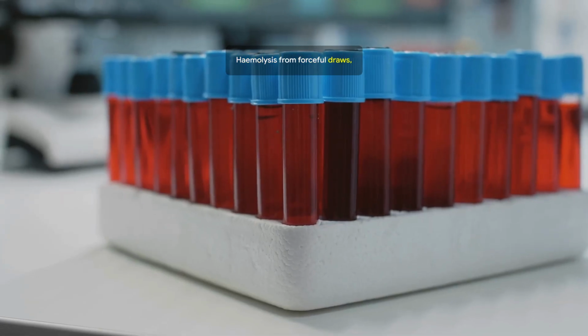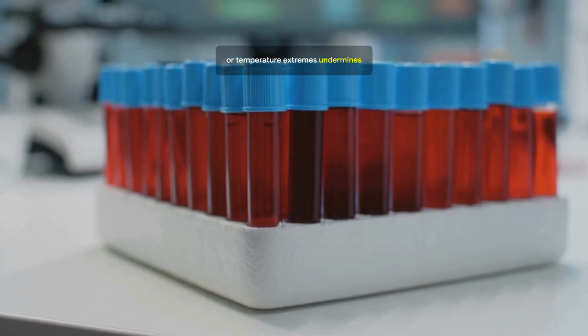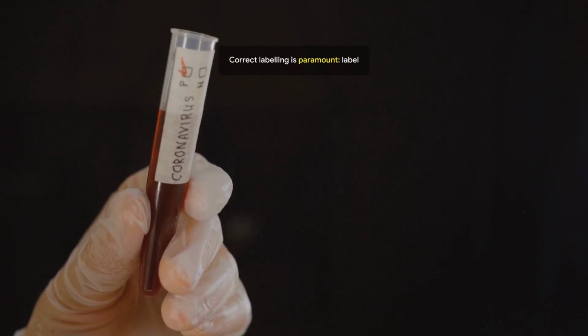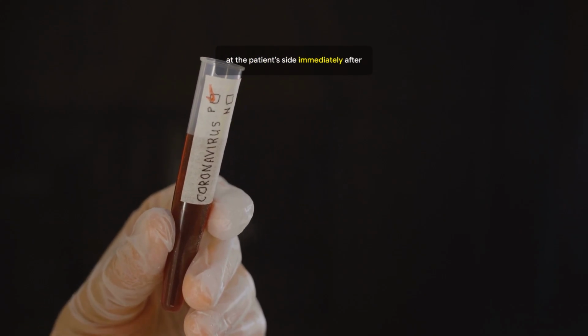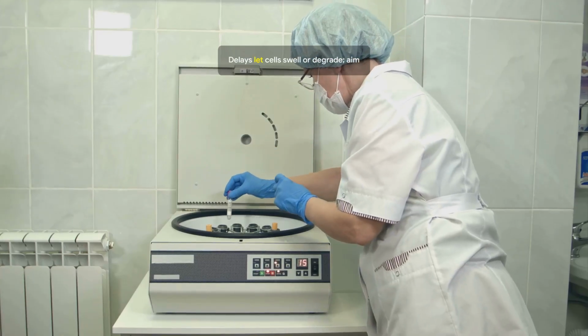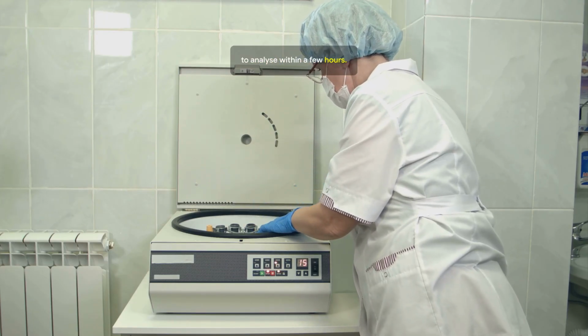Hemolysis from forceful draws, vigorous shaking, or temperature extremes undermines analyzer reliability. Correct labeling is paramount. Label at the patient's side immediately after collection. Never before, never away. Delays let cells swell or degrade. Aim to analyze within a few hours.